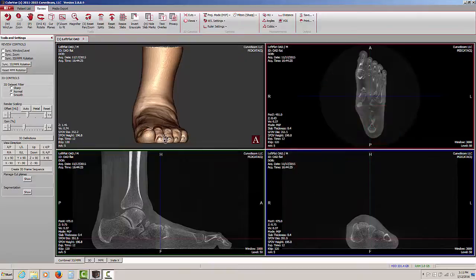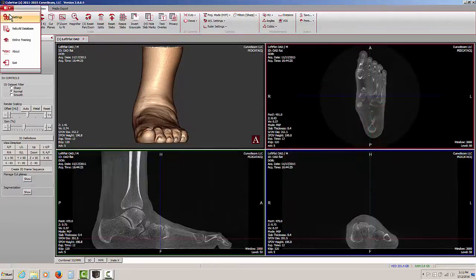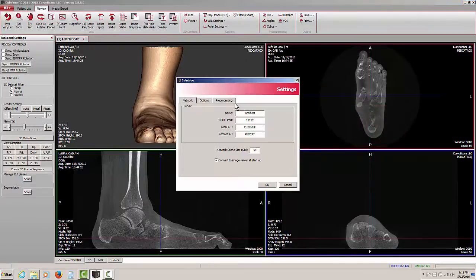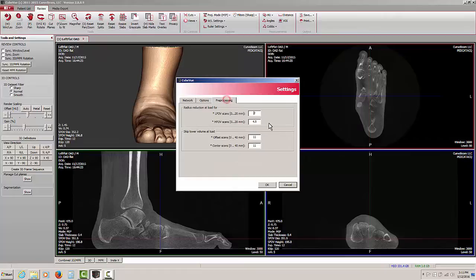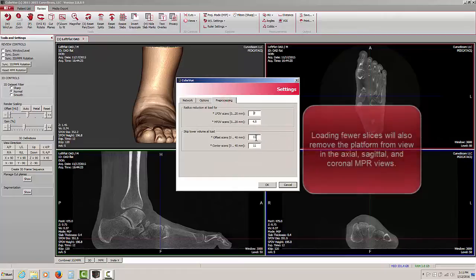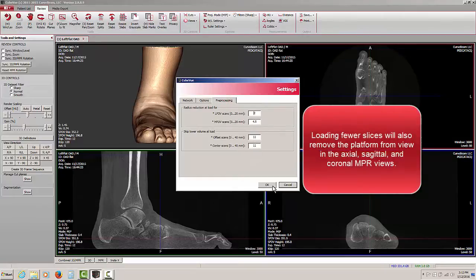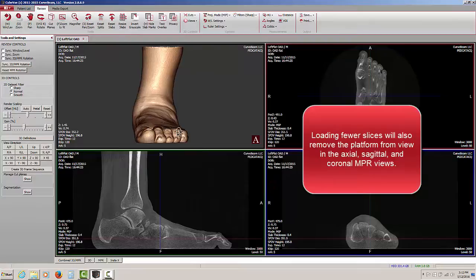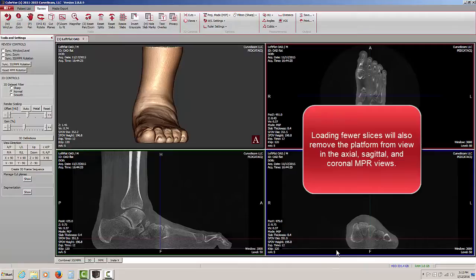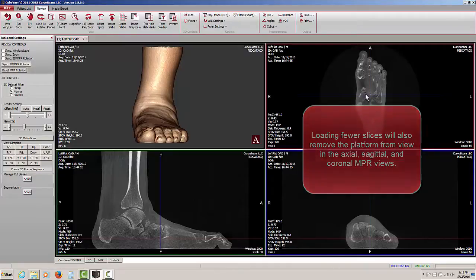In this particular case I went to pre-processing and took off about 11 millimeters from the lower volume at load. I was able to remove the patient platform from the 3D rendering as well as from the sagittal, coronal and axial views.